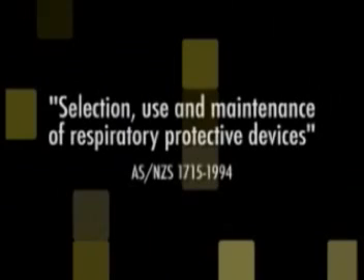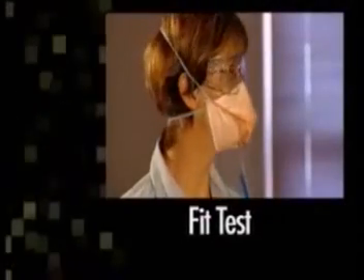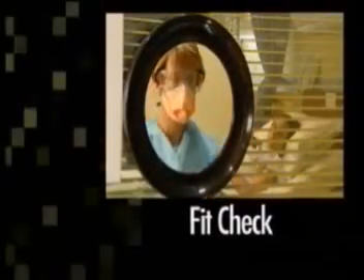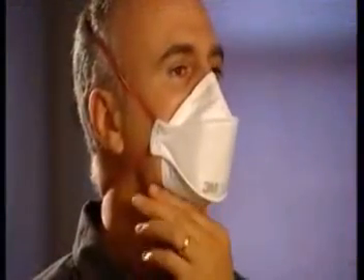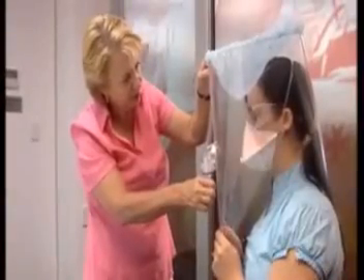The Australian New Zealand standard for selection, use and maintenance of respiratory protective devices advises employers to provide a fit testing process. Fit testing is a validated method of matching a specific respirator mask to an individual face. A fit-check is a quick check to ensure the mask is fitted correctly at the time of use, but fit-checking does not negate the need for a fit-test. A person may achieve a successful fit-check, however this may not translate to a passed fit-test. There are two fit-testing methods identified by Standards Australia.